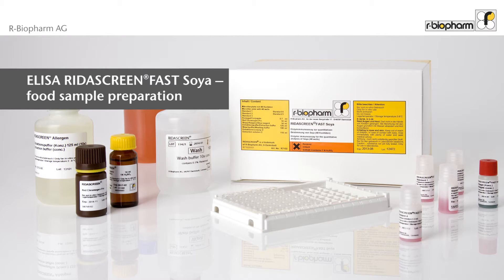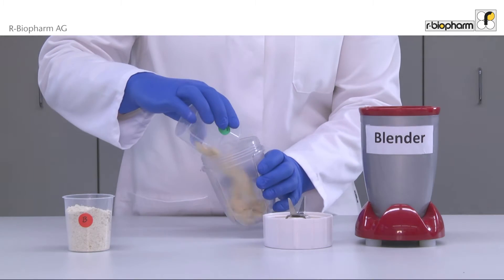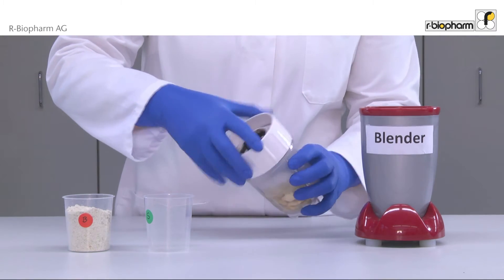ELISA reader screen: fast soya food sample preparation. Even heat-processed soy proteins are detected with the ELISA. A homogeneous sample is a prerequisite; therefore, grind at least five grams of sample. In case of inhomogeneous samples, use a higher weigh-in.